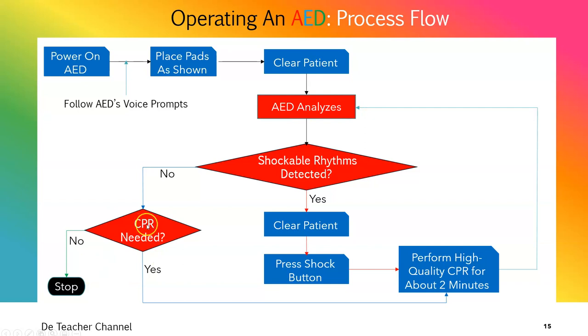But if in this case there is no need to do CPR, maybe this person is breathing or maybe this person is conscious, of course you have to stop. Okay. So if you follow this flow chart or process flow, you will be able to get it.